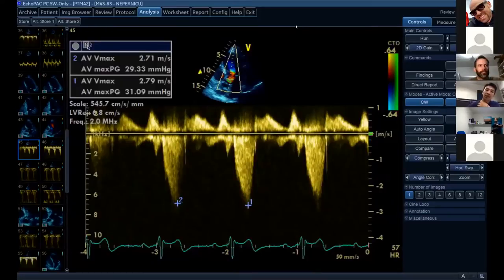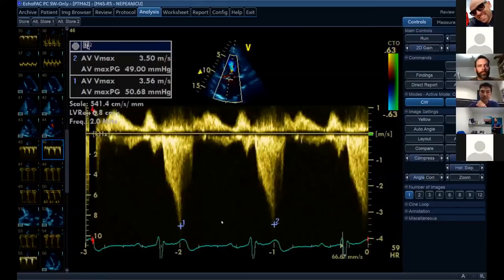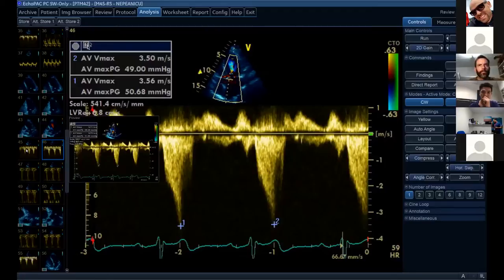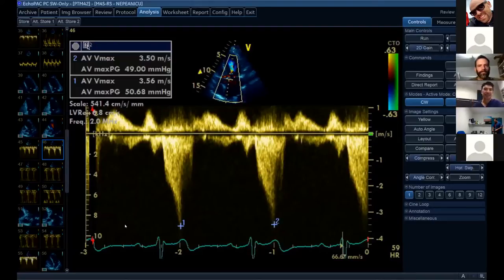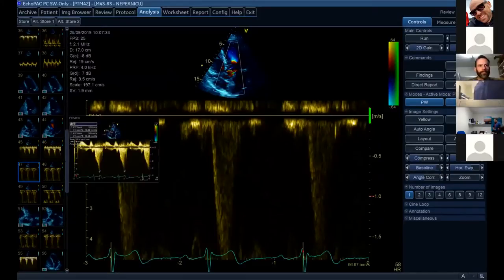On continuous wave Doppler through the apical five-chamber view, there is an increased gradient with a late-peaking, dagger-shaped morphology and high peak velocities — higher than expected — consistent with significant LVOT obstruction.